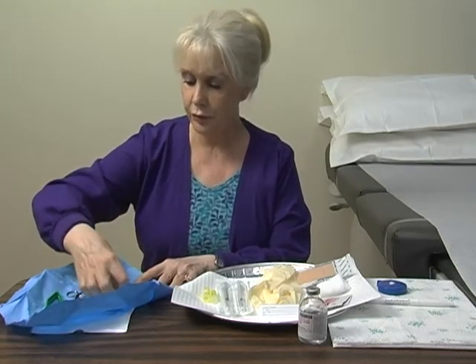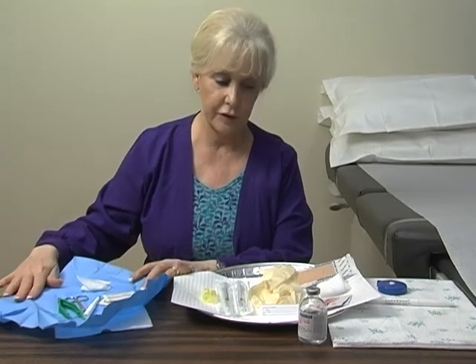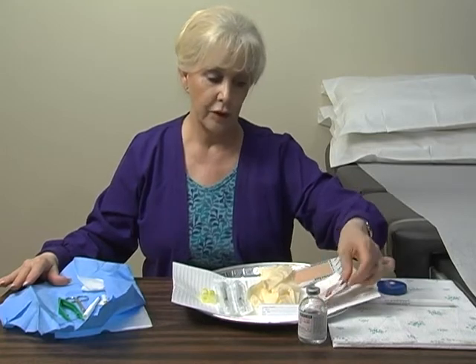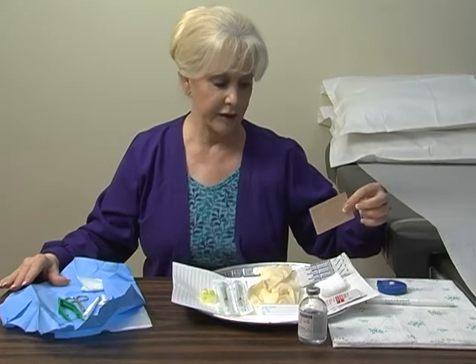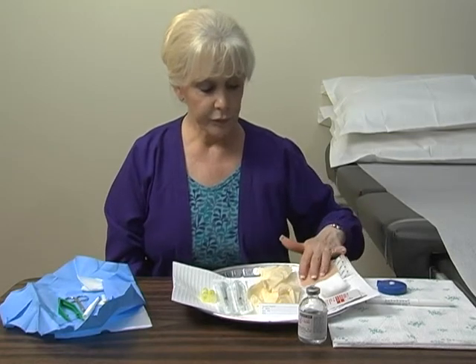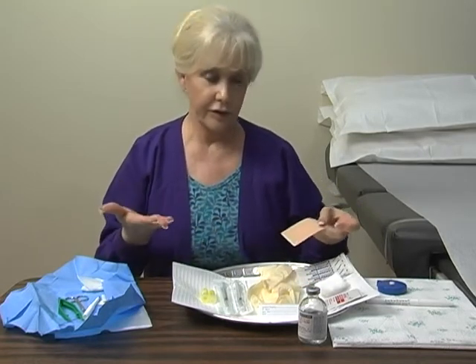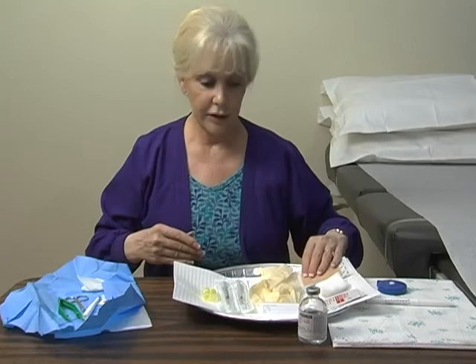There are a couple of two-by-twos and an alcohol swab, which are usually sufficient if you're just doing one biopsy. But if you're thinking about doing a second one, pull out a couple extra two-by-twos and some more alcohol preps. I like to use latex-free four-sided bandages. The idea is to add a little bit of pressure to the biopsy site and seal it on all four sides — this tends to stop the bleeding a little bit quicker and also protects their clothing. That's at your discretion.